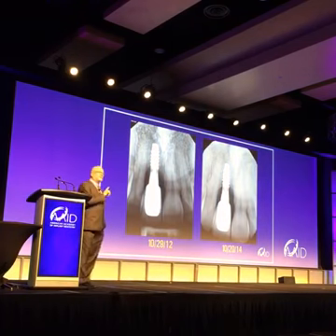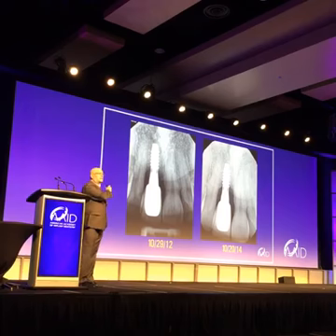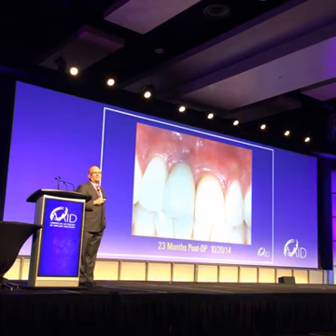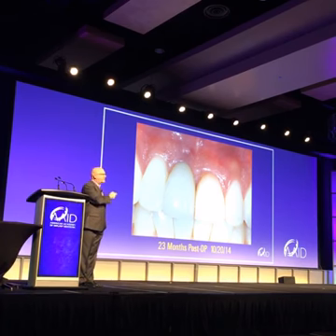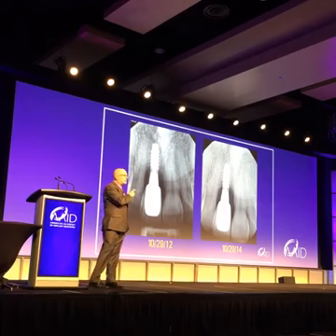But here's the comparison between the two times, 2 years apart. Did I get the bone to come all the way back? No. Would you consider that case a success though? How many would say that's a failure? That's a successful case. I don't need the bone to come back 100%. I just need to have healthy tissue around that implant, and that's going to maintain things.